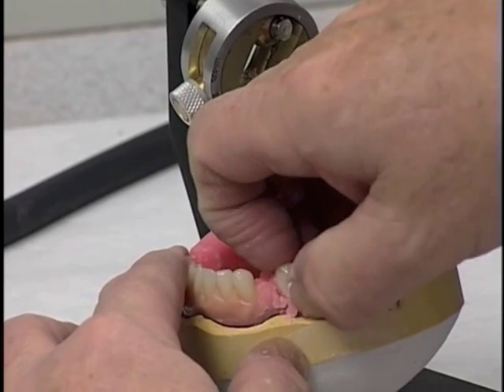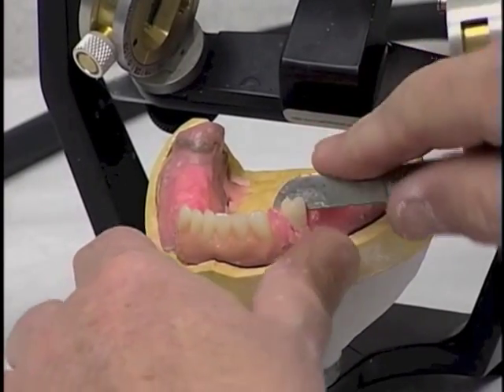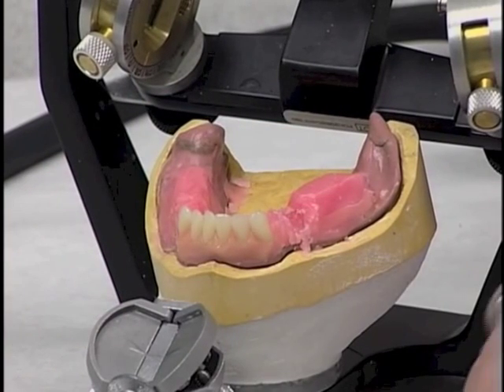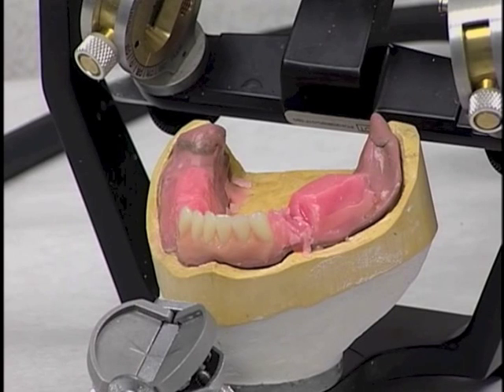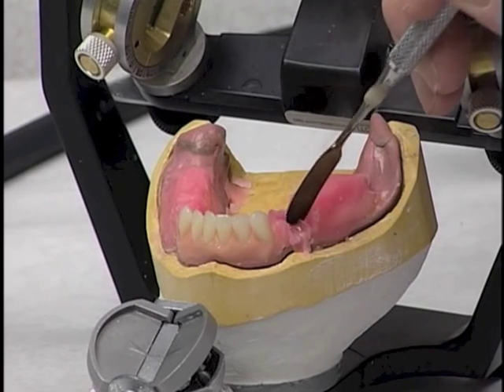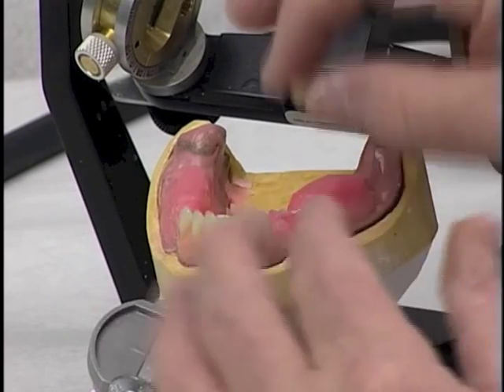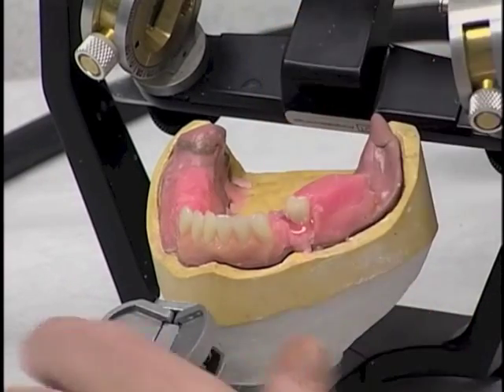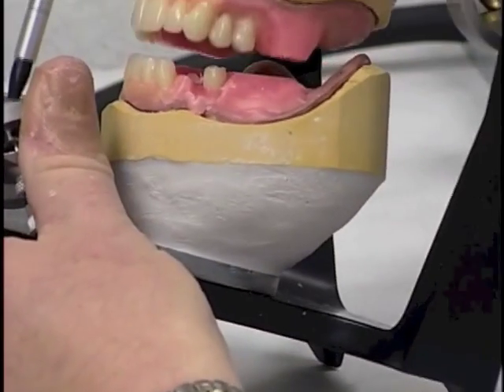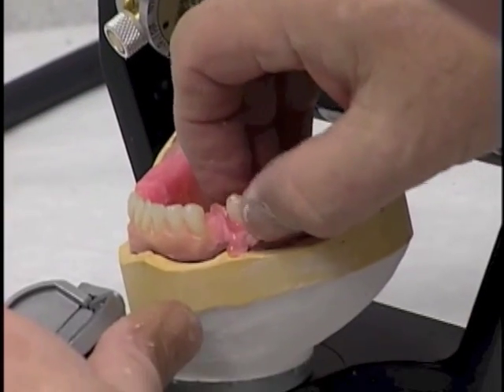So what we'll do, we will remove that mandibular second premolar, pull the wax more, get the wax soft enough to where we can play with that tooth a little bit better. Now let's place the tooth back in again. Too far to the distal, so we want to bring it forward a little now.